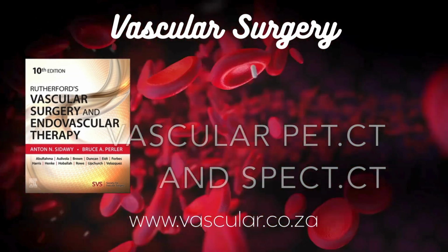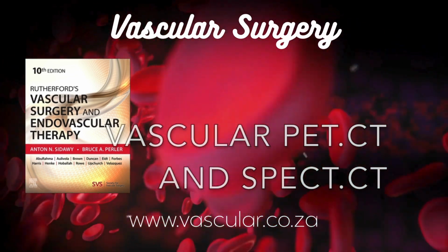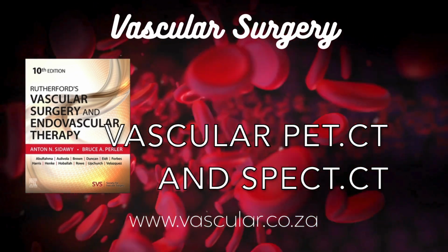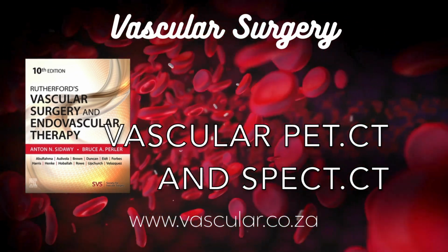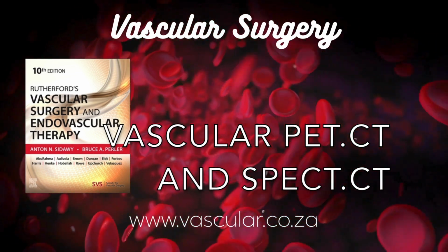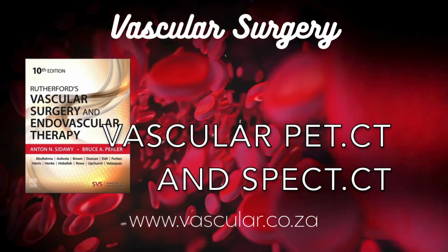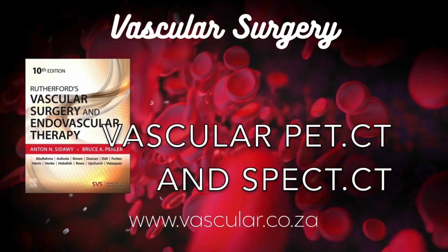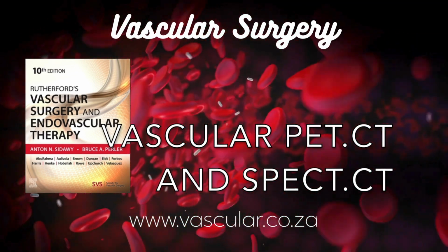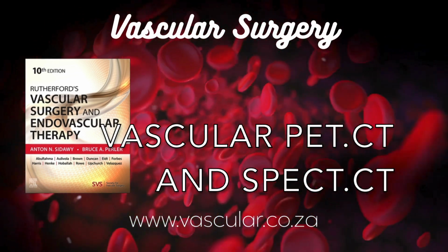Yes, the European Society for Vascular Surgery, ESVS, guidelines, endorsed by the European Association of Nuclear Medicine, EANM, provide a workflow. They usually recommend CT angiography first. If that's unclear, then molecular imaging comes in. For grafts in the chest or abdomen, centrally located, FDG-PET/CT is recommended as the next step. For limb grafts, if things are still uncertain after CTA, either FDG-PET/CT or WBC scintigraphy, preferably SPECT/CT, can be used. Okay, so a structured approach using these tools depending on the situation.